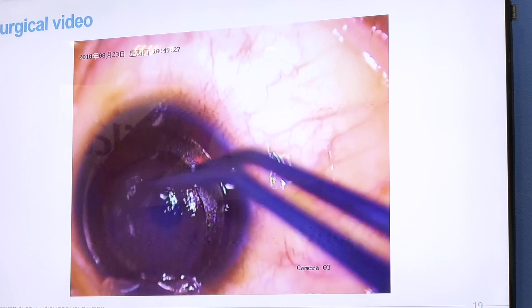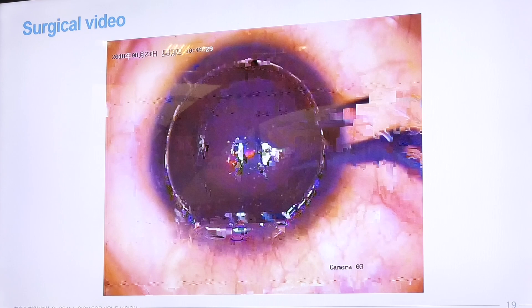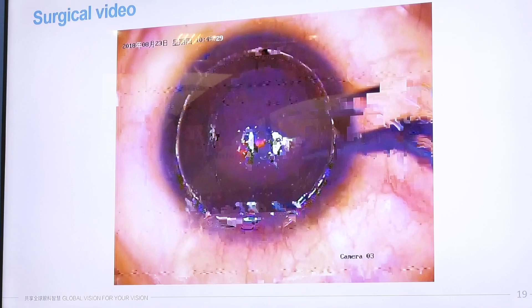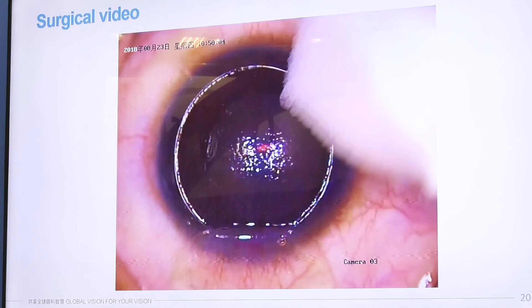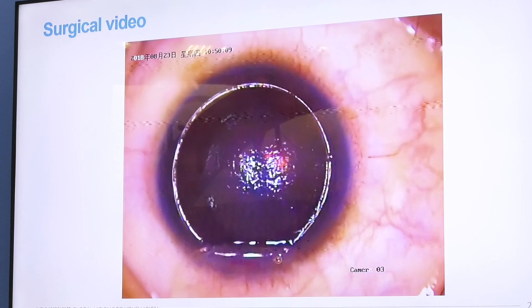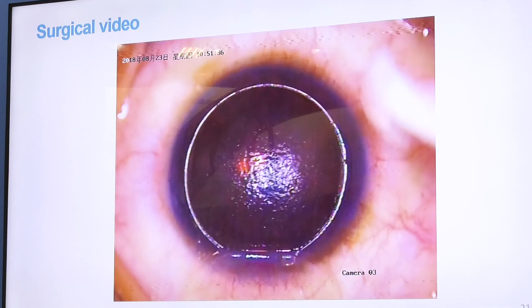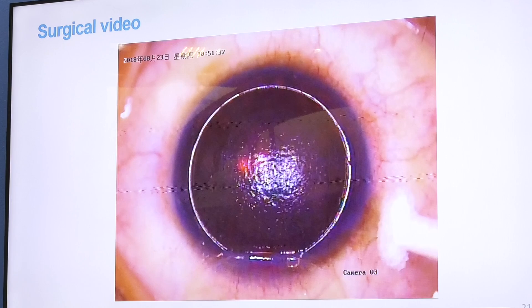This is the lenticle placed on top of the stroma, centered on the first Purkinje reflex. We need to let it air dry for a couple of minutes until it is relatively dehydrated and secure on the stroma.